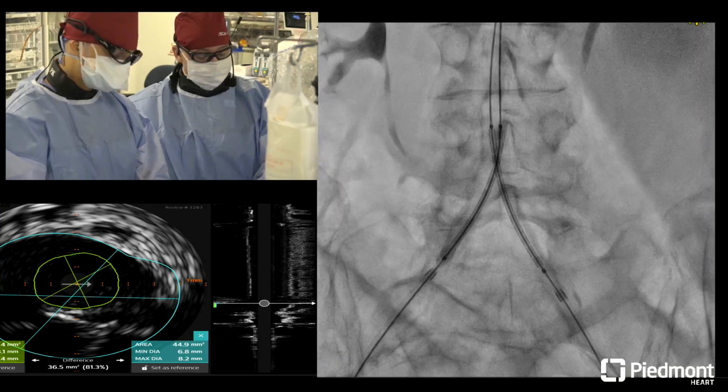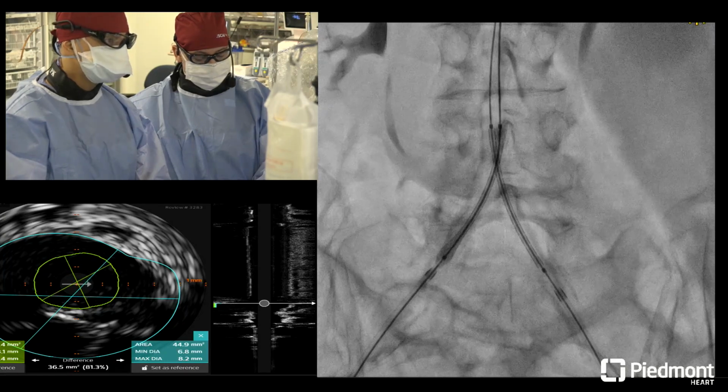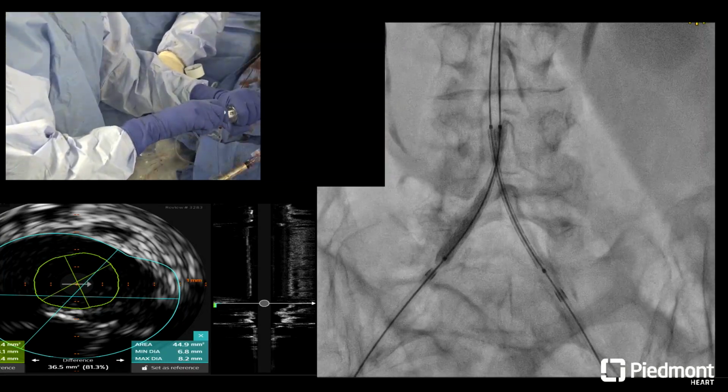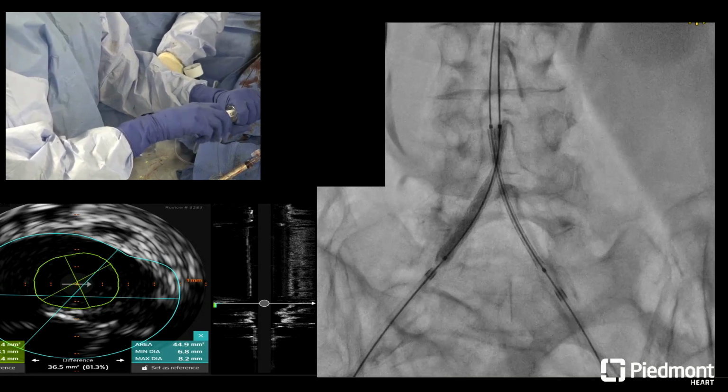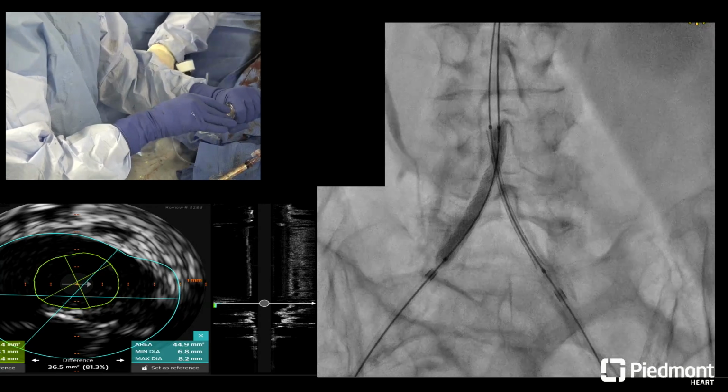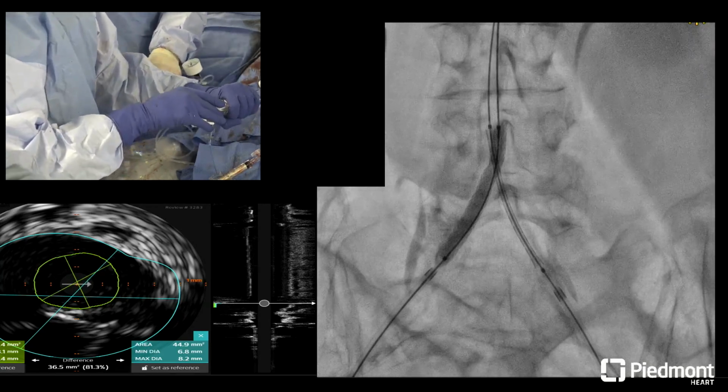It's generally not recommended. Okay, we're at 4, going to 6. It's nominal on this, guys, 12 and 15. Right. What size are these? These are 659 VBX. We're at 6. 7-0. Oh, sorry, 7. Oh, pardon me, 7. So where are you? I'm at 6. 6 as well.